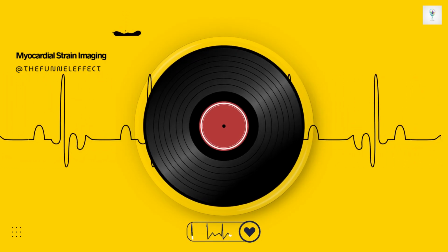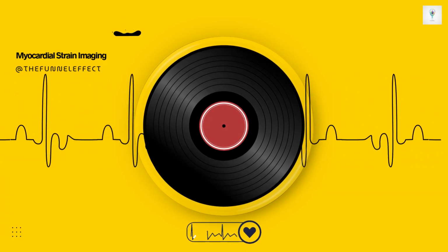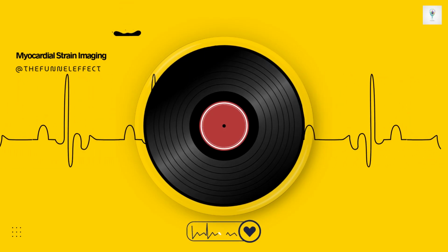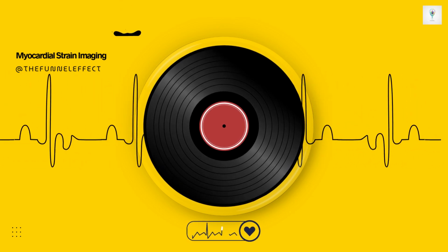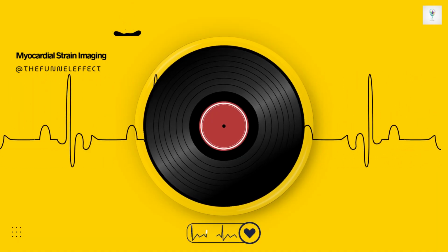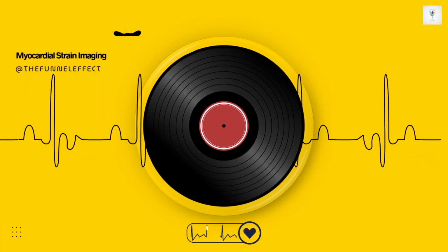Either it's delayed active contraction of an ischemic segment that was stunned but finally manages to contract once the high pressure load drops after the valve closes, or it could be passive elastic recoil of a segment that was stretched and lengthened during systole because it couldn't contract properly. How do you tell the difference between benign and pathological PSS? The key is context. Pathological PSS almost always follows a segment that had reduced shortening during systole itself.